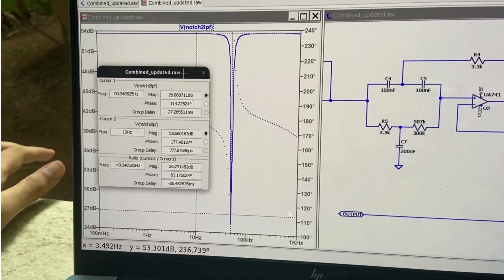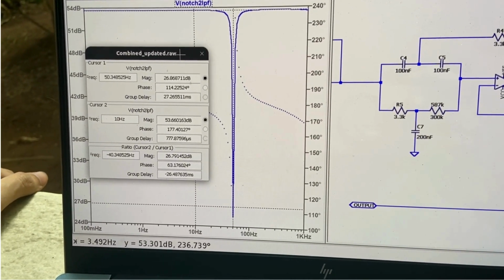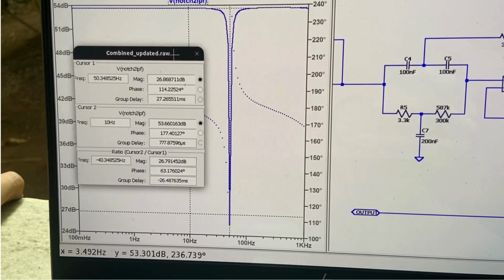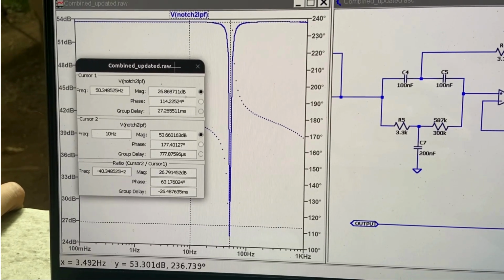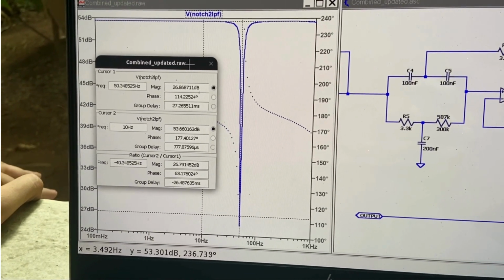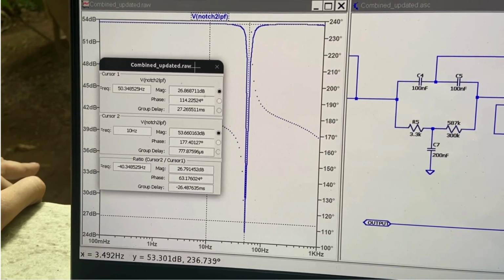In our real implementation of the circuit, we had difficulty producing this exact 50 Hz cutoff, so we had to compensate for the errors in resistors and capacitors by tweaking the value a little bit, by 1 or 2 ohms above or lower than the actual values which we're using in the circuit, and we managed to achieve a cutoff frequency of 49 Hz in our real circuit.